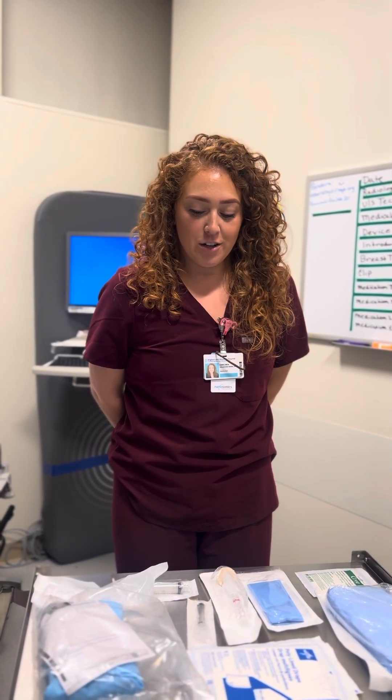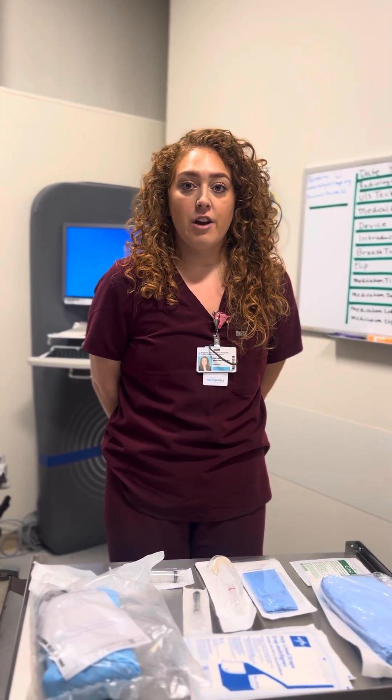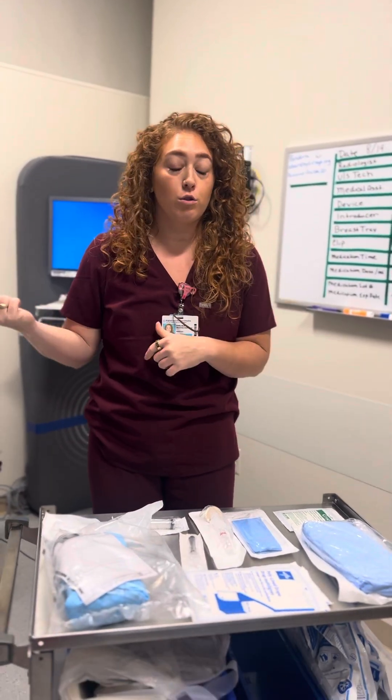Good morning. I'm going to show you how to set up a sterile breast tray for the breast biopsies here at Brigham and Women's under ultrasound guidance.